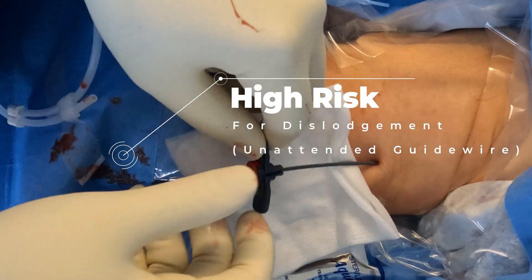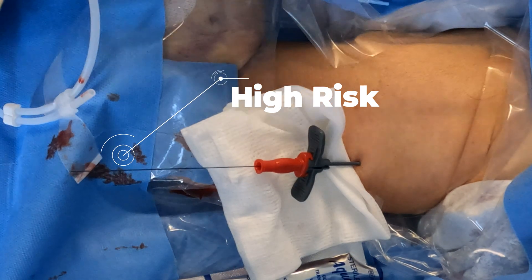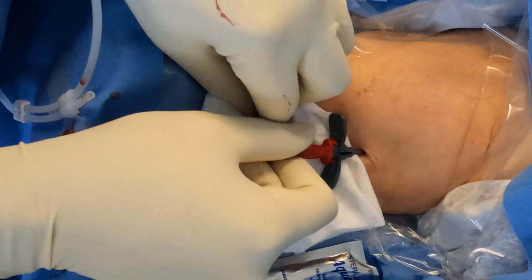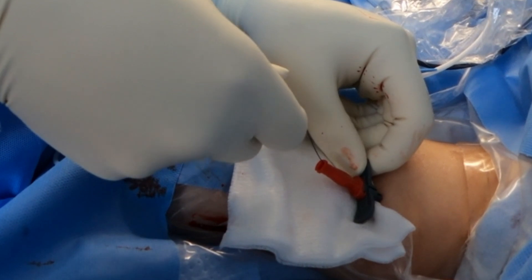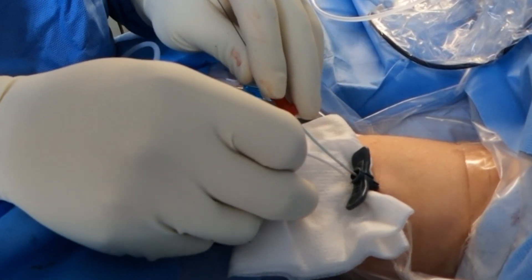This is the Hydromid catheter, so we need to prehydrate it. I forgot to show you that part, but you want to prehydrate these catheters before starting. I'm actually just going to pull the whole thing out and get the catheter ready.